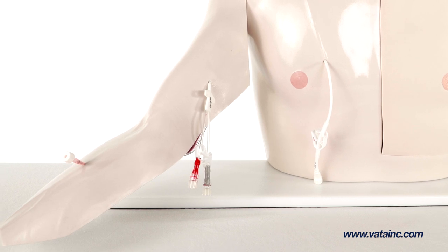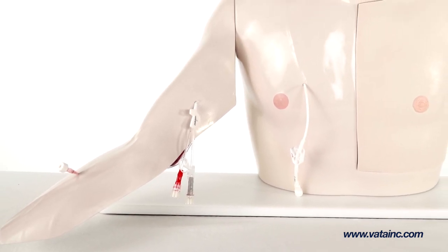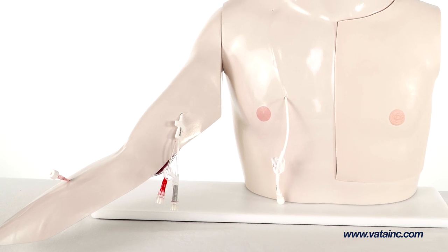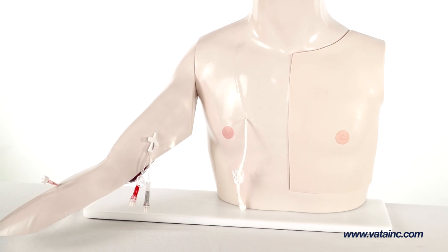This realistic model makes learning to palpate and access implanted ports simple and straightforward, as well as the ability to practice infusion, withdrawal, securement, and dressings of multiple vascular access lines.